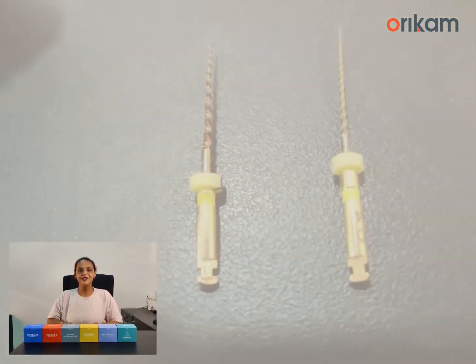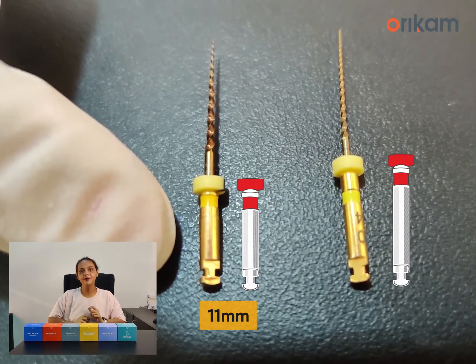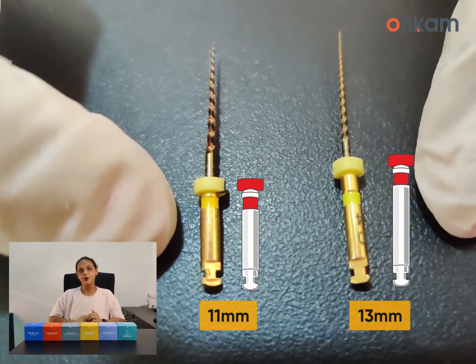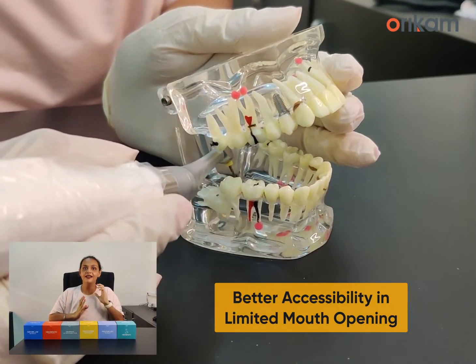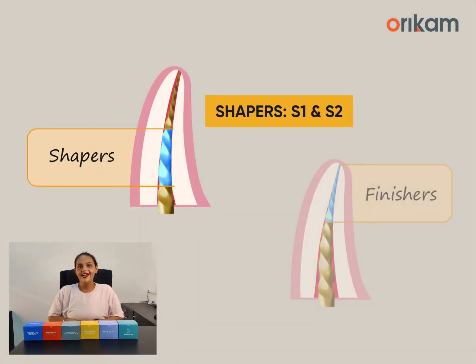Another interesting feature of this file system is the size of the shank. It has an 11mm shank size compared to the regular 13mm, which provides greater accessibility and visibility in cases where there is limited mouth opening. NeoTaper file system has a progressively variable taper on the active portion of the file.